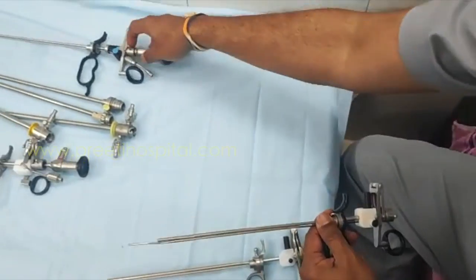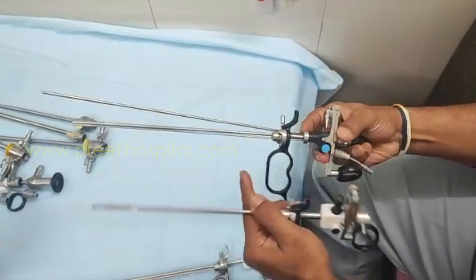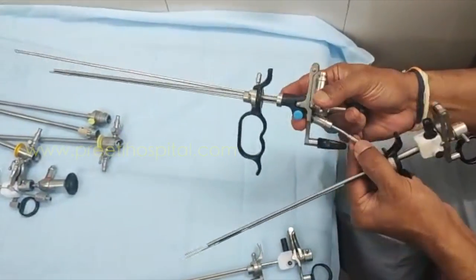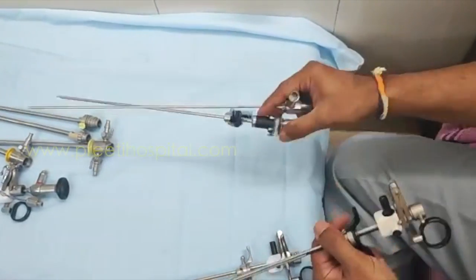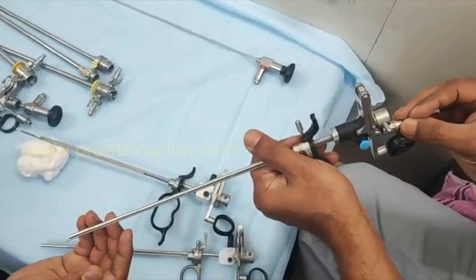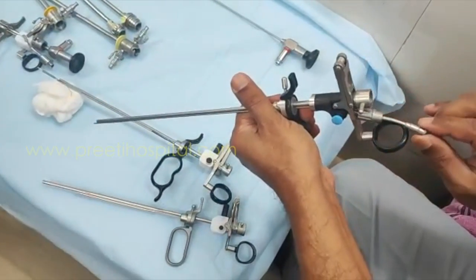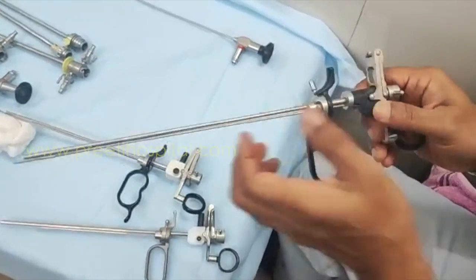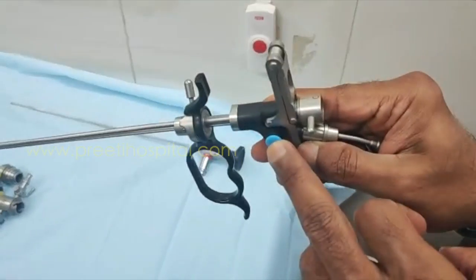This working element is for the laser channel. There is a slight bend here, and it is slightly rotatable. You can keep it like this and tighten. This is the laser cap — you turn here to make it loose.